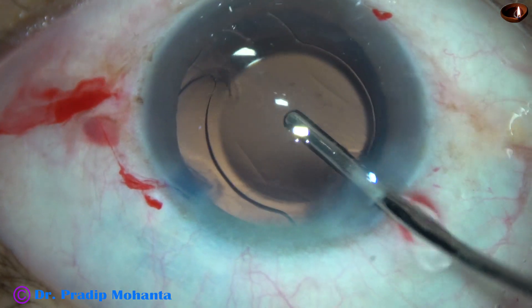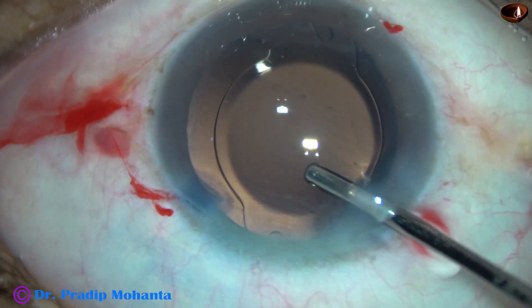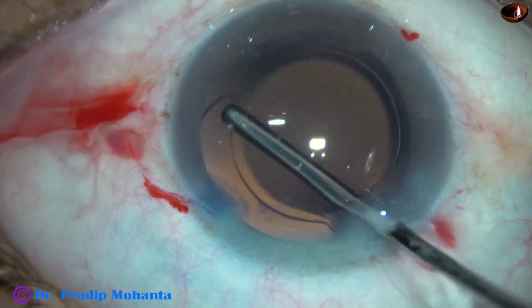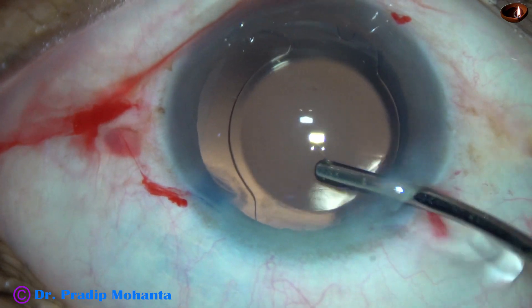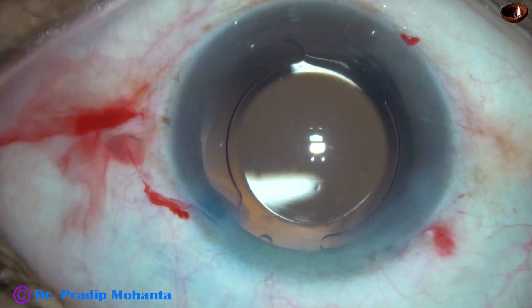And now, how to place the lens? There is extension of the capsule at 2 o'clock. So I am placing the haptics in this way at the 1 o'clock and 7 o'clock meridian.